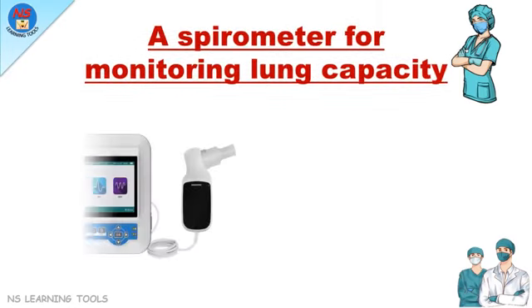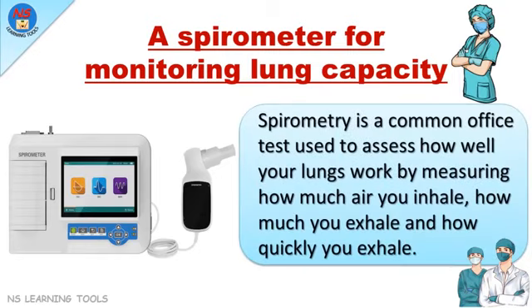A spirometer for monitoring lung capacity. Spirometry is a common office test used to assess how well your lungs work by measuring how much air you inhale, how much you exhale, and how quickly you exhale.